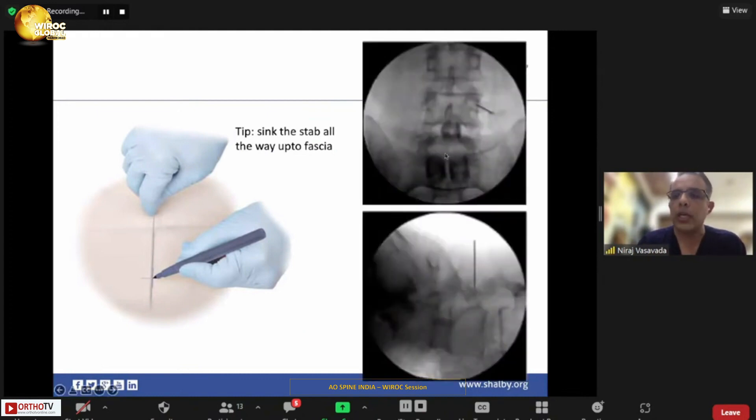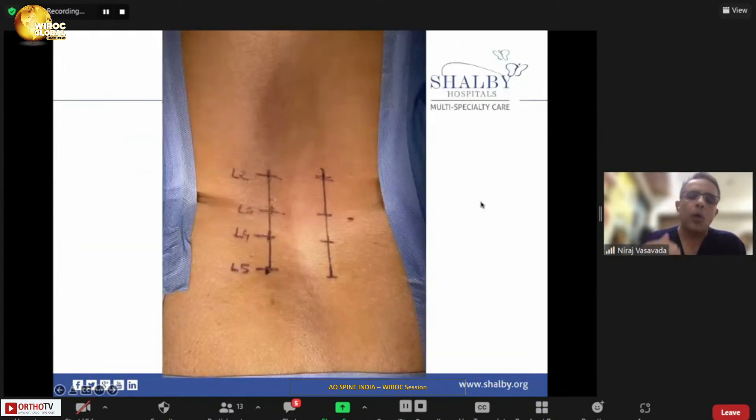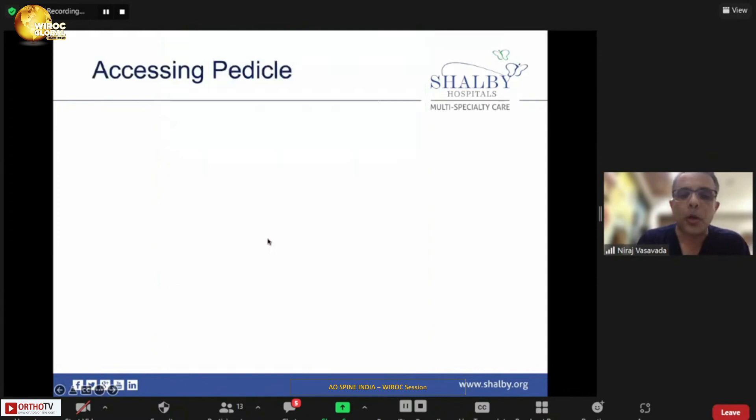You start at the three o'clock on the pedicle and target nine o'clock. When doing a multi-level screw insertion, I always try to mark all entry points — the three o'clock position of each pedicle — and draw a line. If you don't draw a line, when putting upper or lower level screws, they may not be aligned, and later when you want to put a rod, misaligned screws will make rod placement difficult. When all incisions are aligned, needle and screw placement becomes easier.